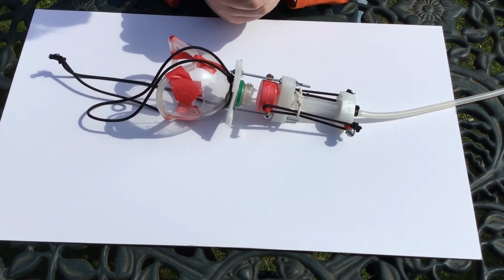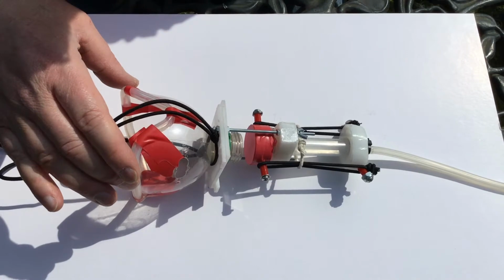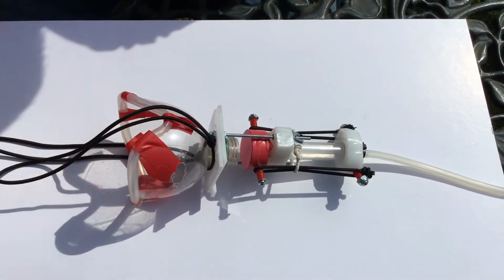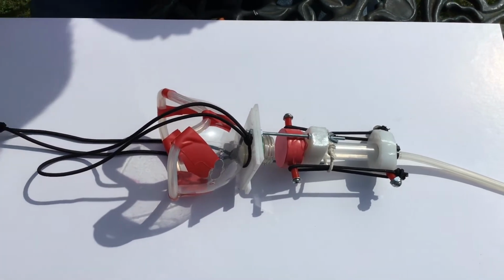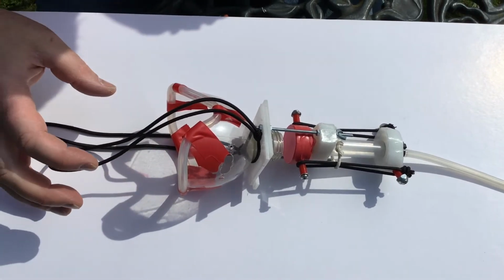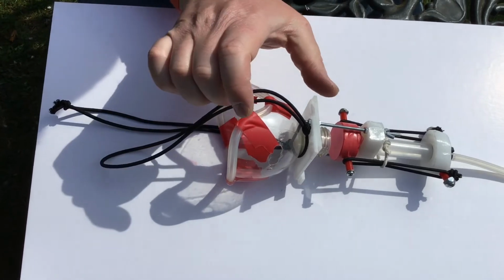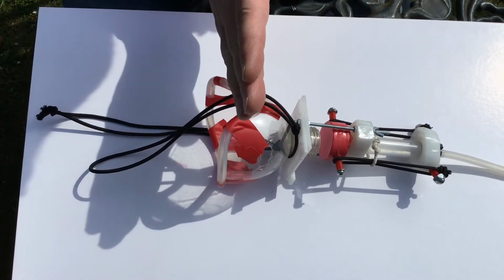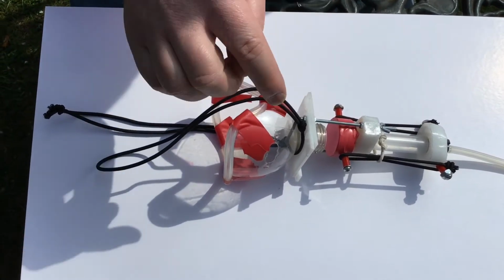Now let's look at each one of those points in turn. Here we have the carbonated bottle face mask. Now shaping this wasn't done easily. We started off with a long bottle and attempted to cut the correct face shape out of it, and when we finally achieved the correct face shape, then we just shortened it to make it a practical length. In fact, I still think this face mask is a little bit too long, and perhaps a 3-litre bottle would have created a better face mask.